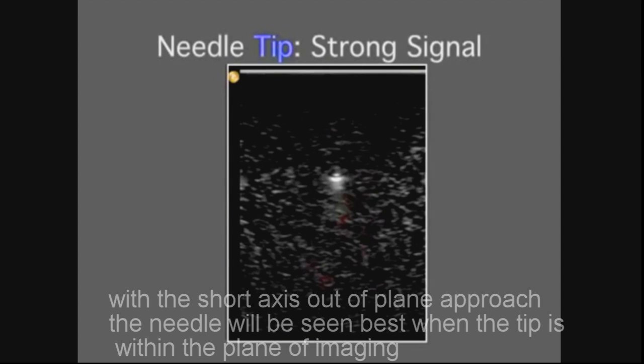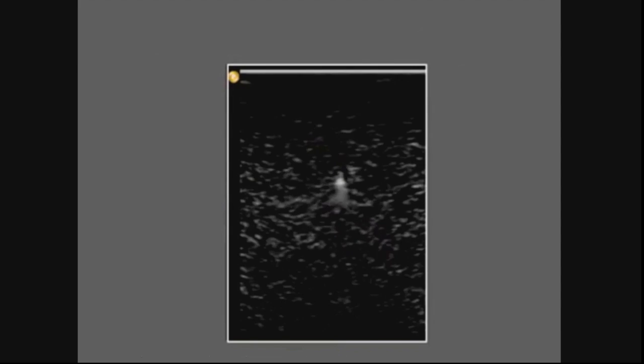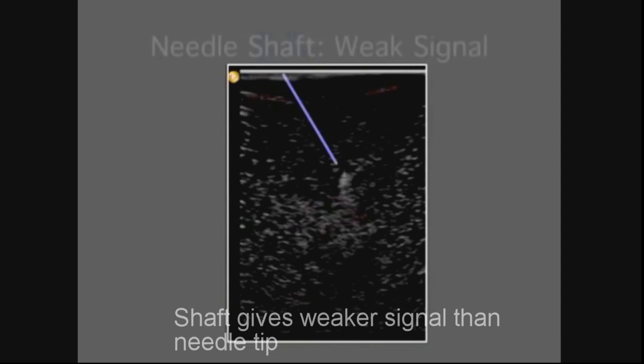With a short axis out-of-plane approach, the needle will be seen best when the tip is within the plane of imaging. Shaft gives weaker signal than needle tip.